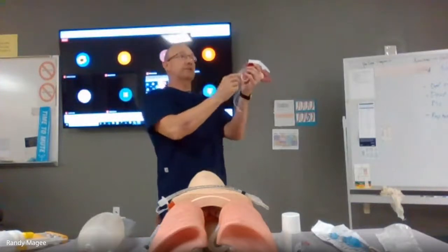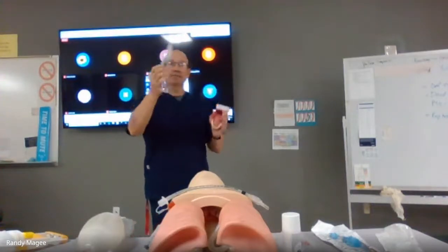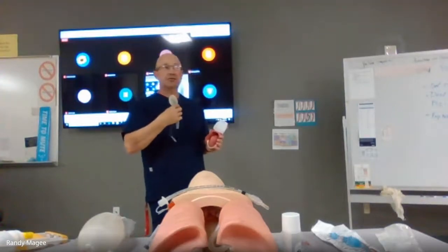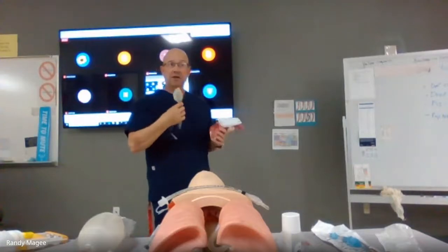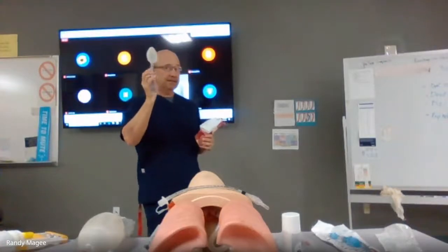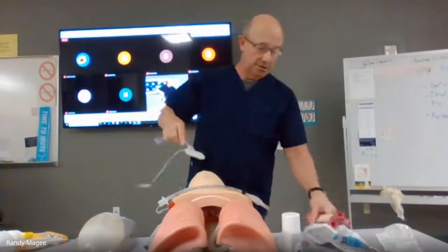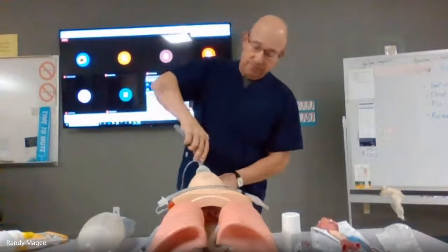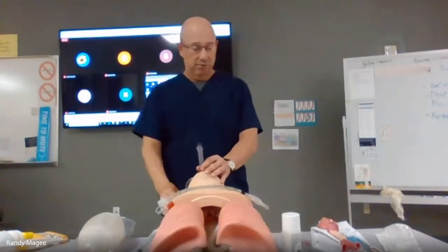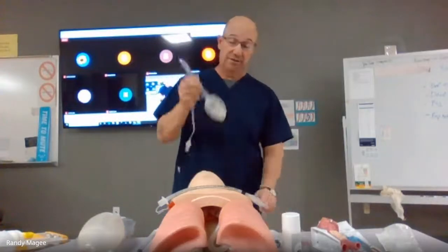over the epiglottis. It's an okay airway, but one of the flaws in the design is that it doesn't protect against secretions. So if the patient vomits or they have a lot of secretions or blood, not a good airway, because this is not definitive control by any means. So it just sort of sits in there, but if I was to put this in there, I'd just shove it in, get it and then put 30 cc's of air in the cuff. And there's different sizes for different people.